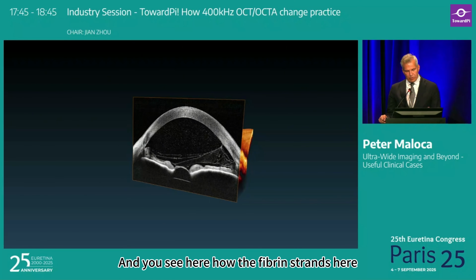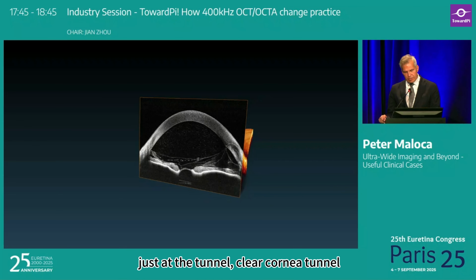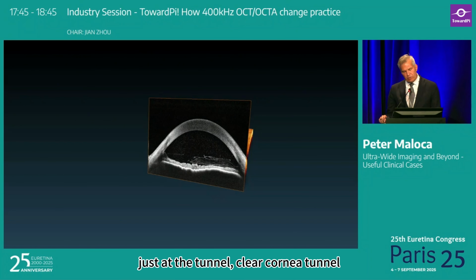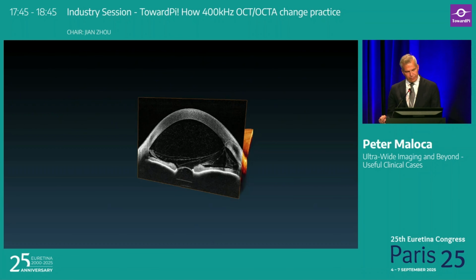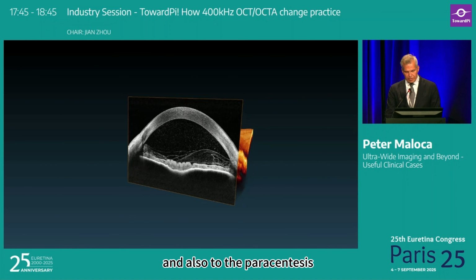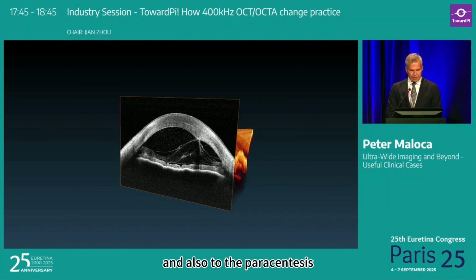And you see here how the fibrin strands, just at the tunnel, clear cornea tunnel, is attached to that opening there. And also to the paracentesis here.